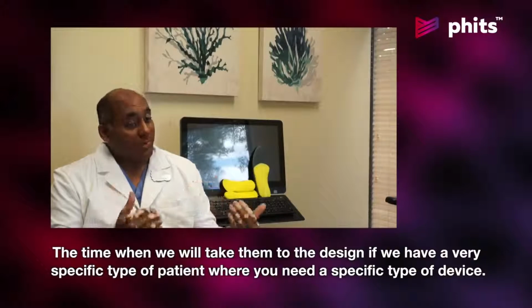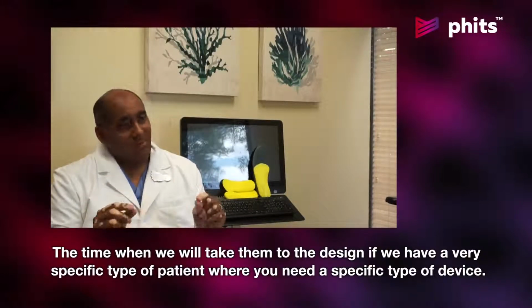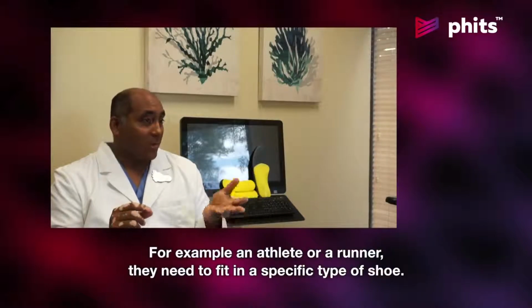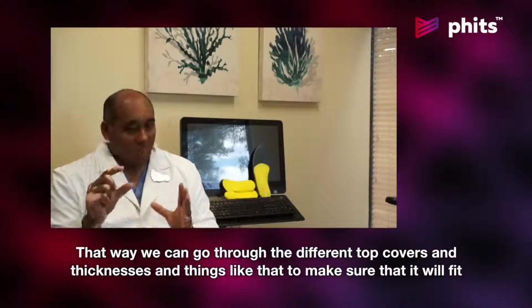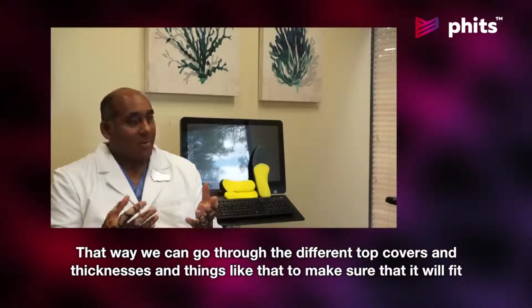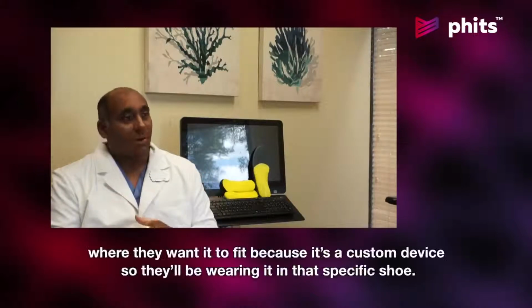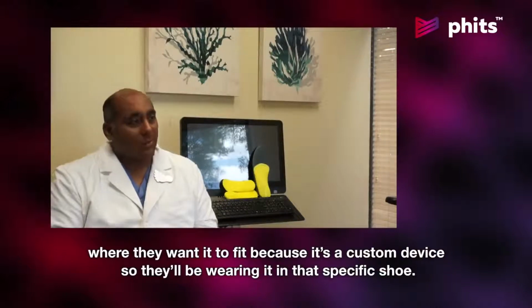We will also take them through the design if we have a very specific type of patient who needs a specific type of device, for example an athlete or a runner who needs to fit in a specific type of shoe. That way we can go through the different top cover thicknesses and things like that to make sure it will fit where they want it to fit, because it's a custom device they're going to be wearing specifically in that shoe.